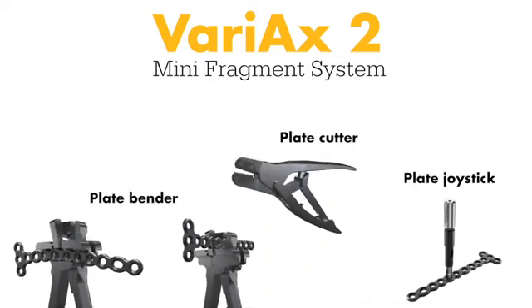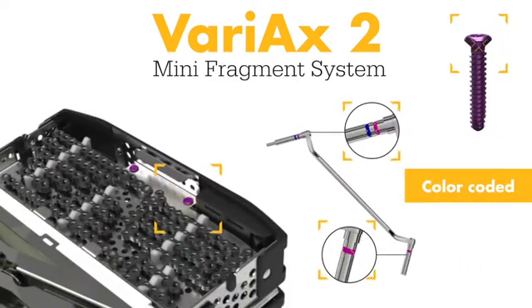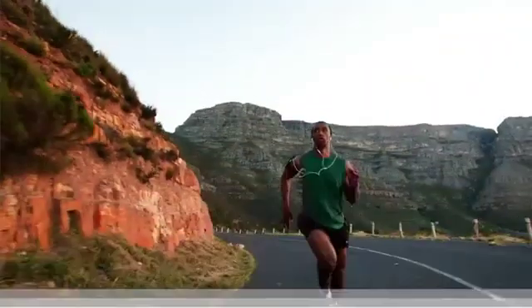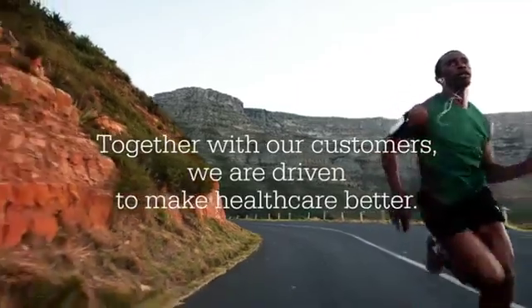The system features a streamlined and simplified instrument platform and a compact tray design to help increase procedural efficiency. Together with our customers, we are driven to make healthcare better.